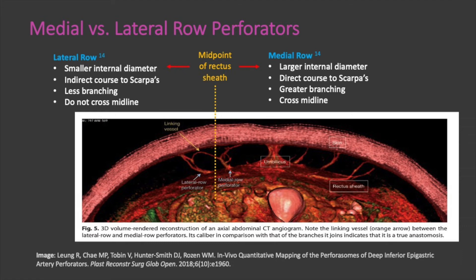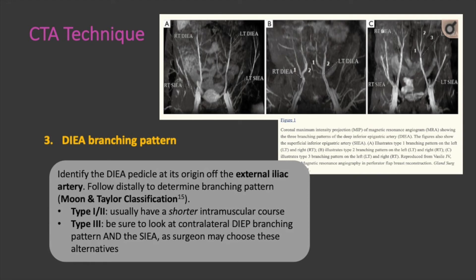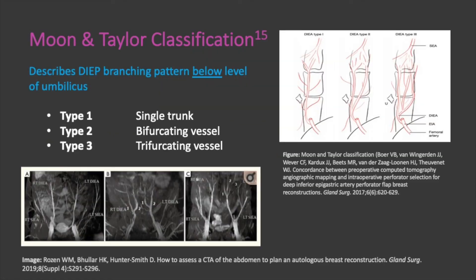Next, it is important to identify the DIEA pedicle at its origin off the external iliac artery. The artery should be followed distally to determine its branching pattern, which can be classified according to the Moon and Taylor classification. Type 1 and 2 vessels usually have shorter intramuscular courses and are therefore favorable, while type 3 vessels are unfavorable, and attention should be given to the contralateral deep in case the branching pattern is more favorable. The DIEA has classically been described as having three distinct branching patterns, distributing five to six major perforators to the muscle and overlying subcutaneous tissues. Type 1 has a single trunk, type 2 has a bifurcating vessel, and type 3 has a trifurcating vessel. This branching pattern is specifically described below the level of the umbilicus.